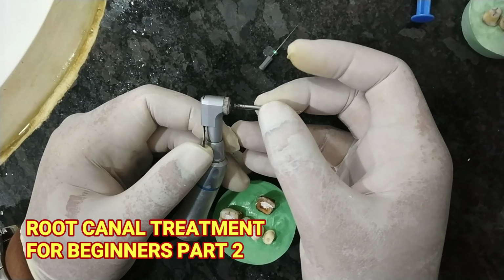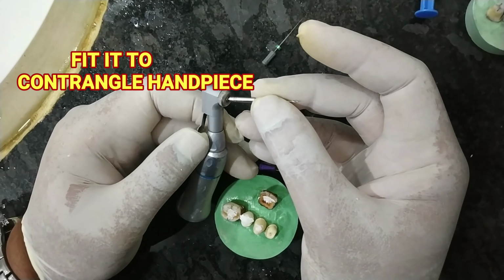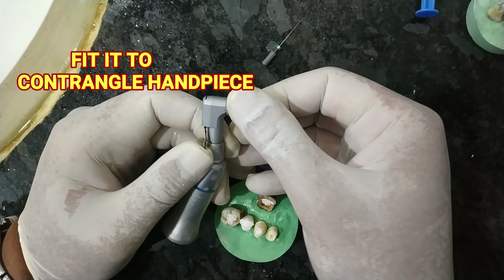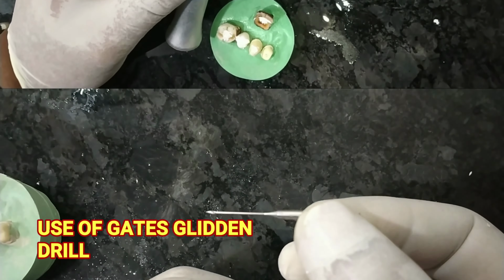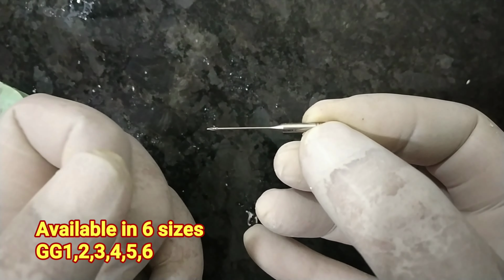So this is the micromotor and this is the way we use our Gates Glidden drill. So we put it like this, lock it. So this is the Gates Glidden drill number 1.